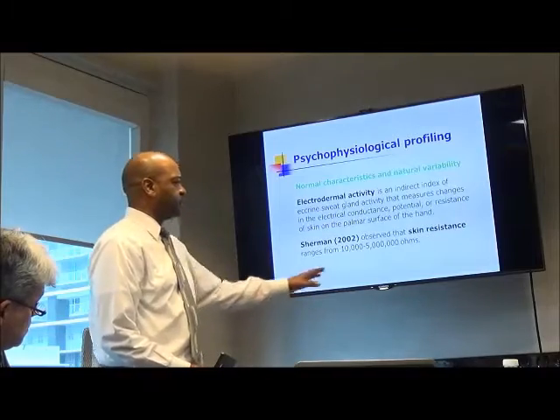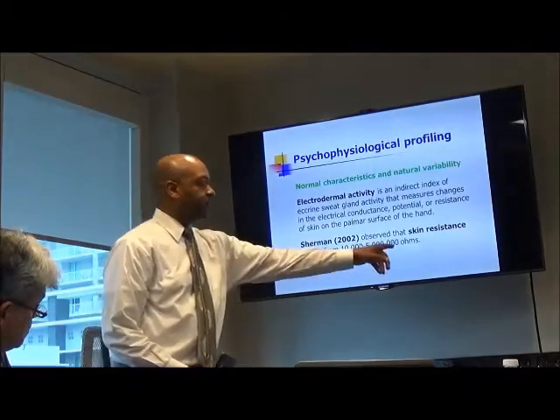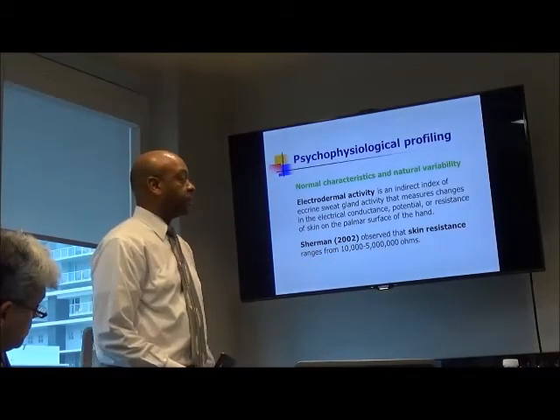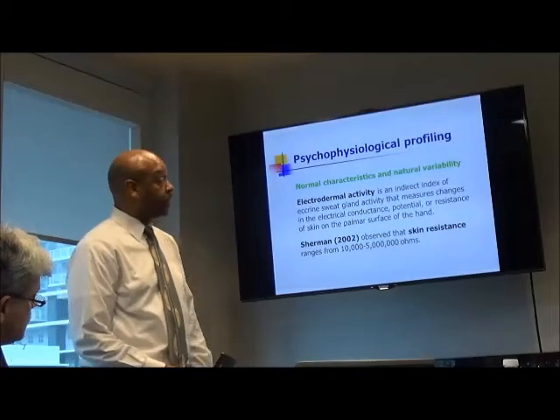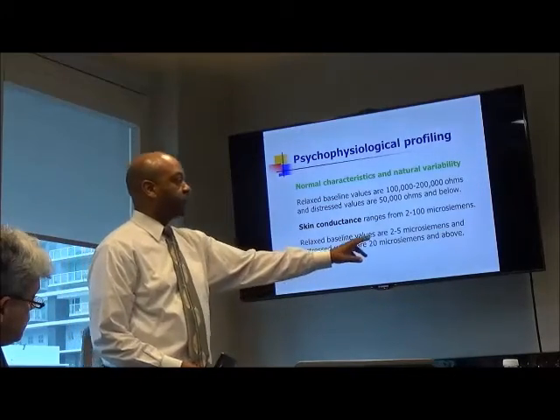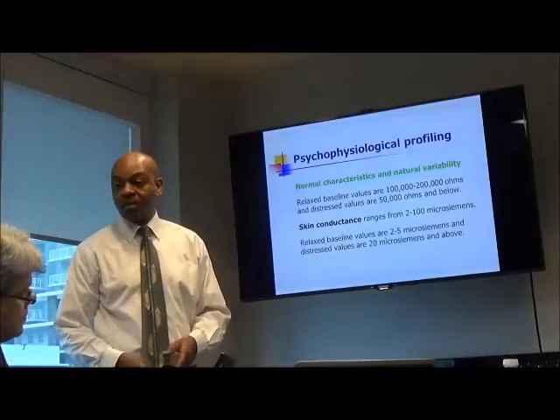And the resistance is measured in thousands of ohms usually. So here it's saying ohms, but you may see K ohms instead. How's the conductance measured? I was confused about that. Well, this is resistance. Conductance is going to be measured in what they call either microsiemens or micromhos.